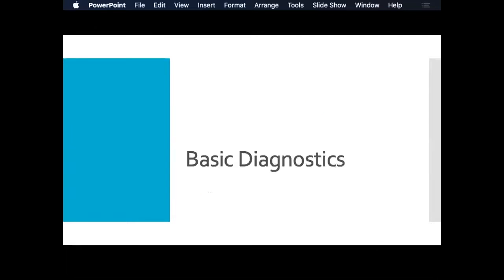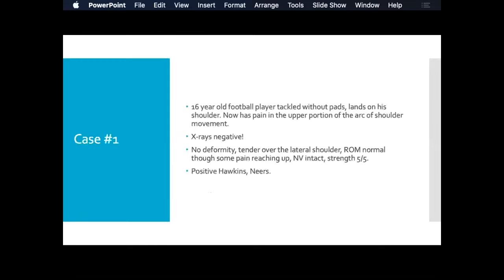So some basic diagnostics that we'll go through. We'll do this in terms of just some cases. The cases are probably really straightforward, but we'll be showing how to use ultrasound in conjunction with your actual physical exam diagnostic skills and history taking.